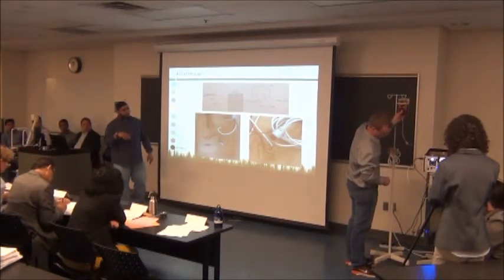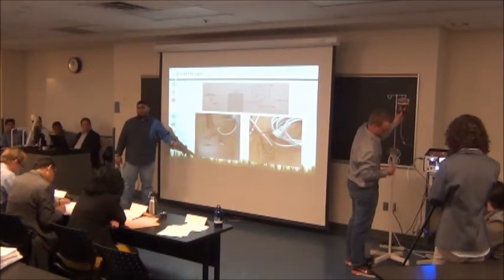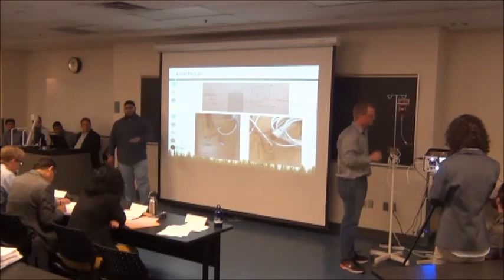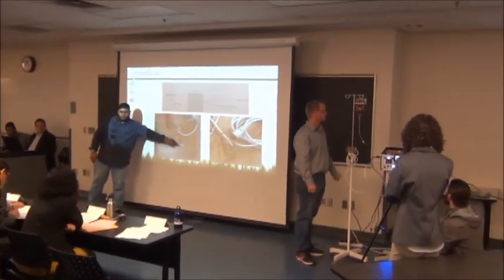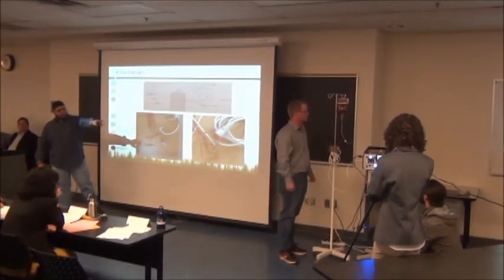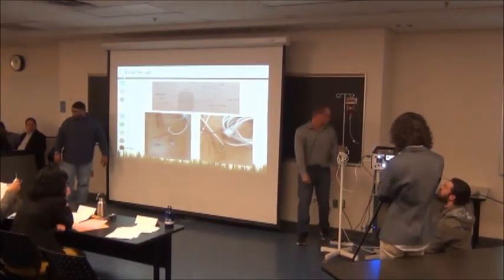With the bridge circuit, we always have to adjust the zero baseline, just like they have to adjust the pressure on the normal blood pressure monitor. So we had a pot for that. We replaced it with a bigger pot, as we can see on the transparent box. That's our bridge circuit.